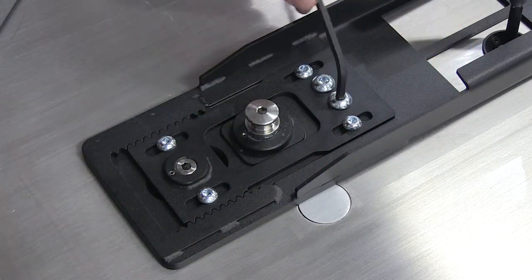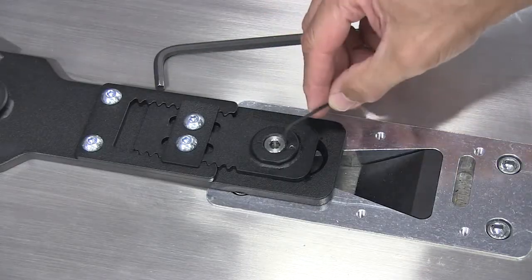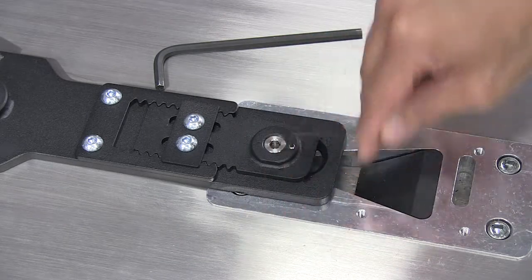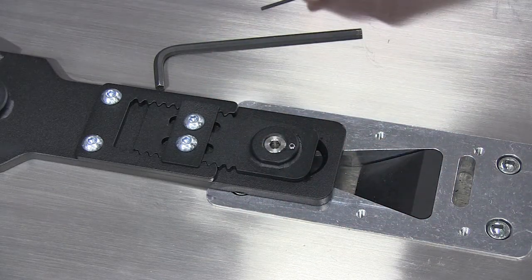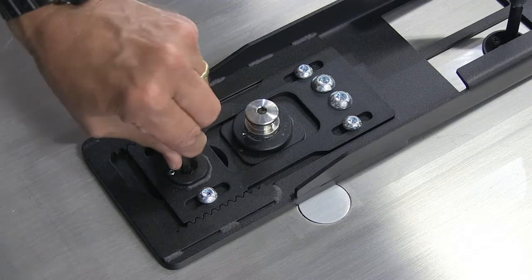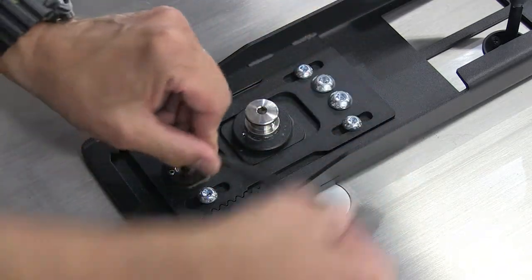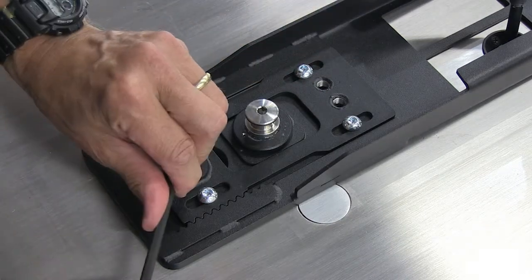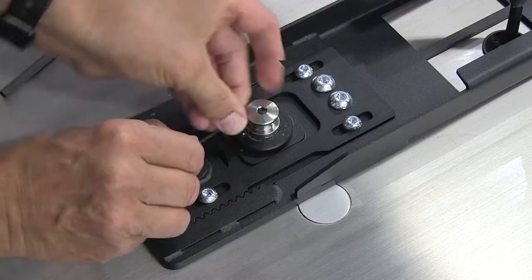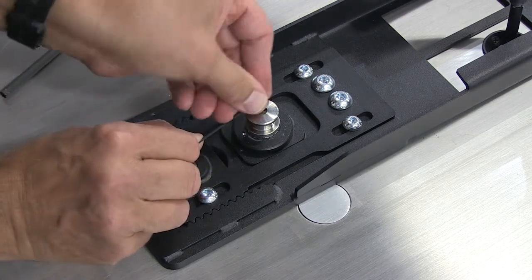Consult the mounting block floor system installation manual under Installing the mounting rail. If the set screw was not already loosened to adjust the lower post, use a 2 mm Allen wrench to loosen the set screw in the mounting post at each end of the mounting rail. Use a 6 mm Allen wrench to tighten or raise each mounting post inside the slot of the mounting blocks until the mounting rail is tight against the floor of the vehicle. Turn counterclockwise to raise the post. Use a 2 mm Allen wrench to tighten the set screws in the mounting posts at each end of the mounting rail.